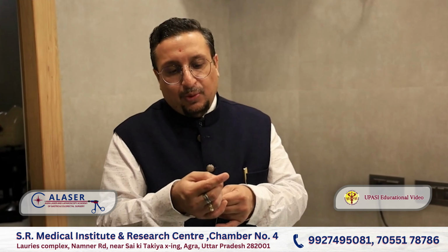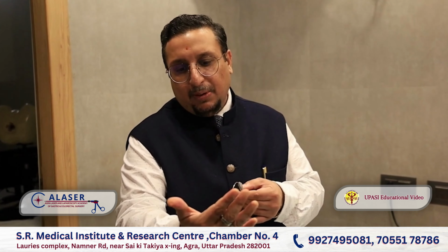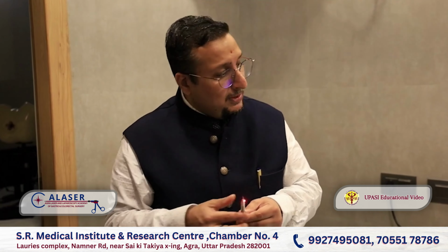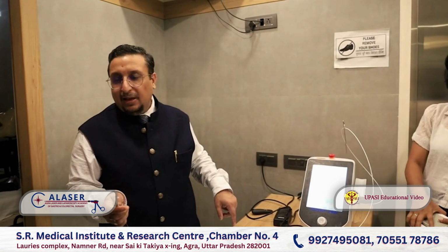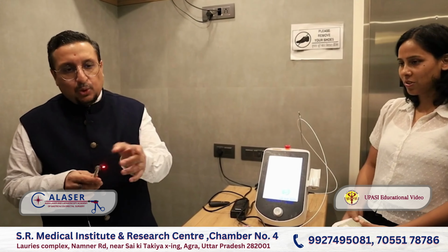Third thing, you have to feel the light is on, but the energy is not on. I told you the concept. What is this called? Anyone? This laser light is called the aiming beam. This is not a laser light. This is only the aiming beam, right? When she presses this, then the energy will be delivered. That is all. So this is only the aiming beam.